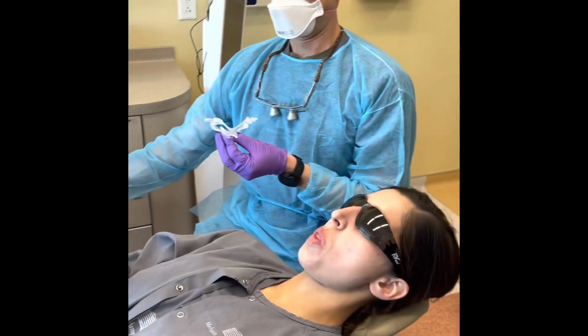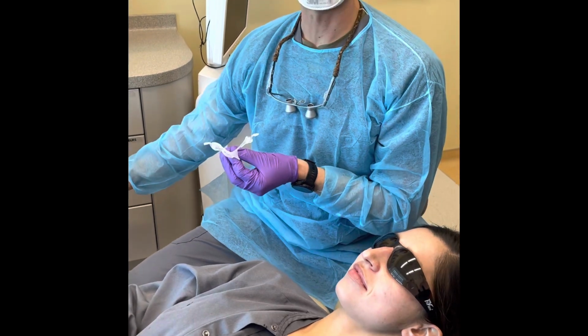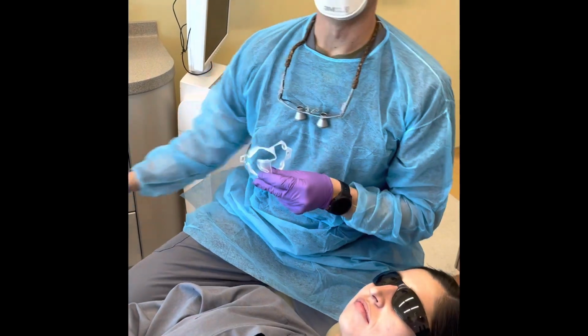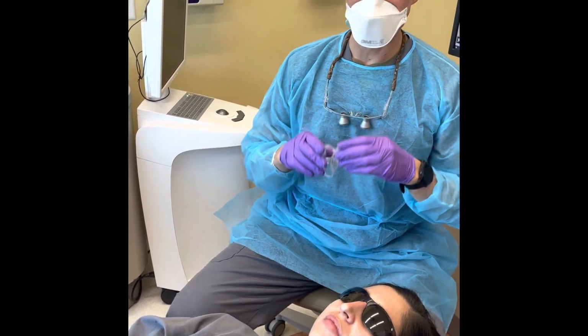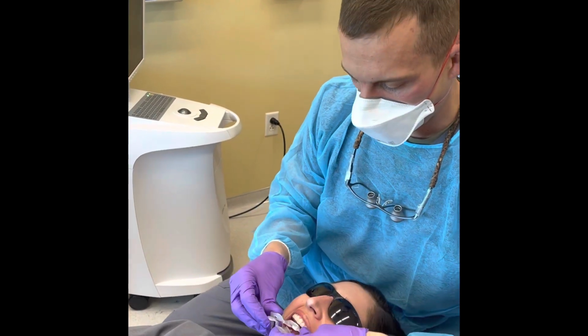All right. You need light? No light, nope. And so this scan should take us maybe about 10 minutes maximum. And it should have cross-arch accuracy, probably somewhere in the range of 80 microns when it comes to the cross-arch. And when it comes to tooth, it should be about 35 microns. So almost just as accurate as a PVS impression. All right, we're going to go ahead and put this in.